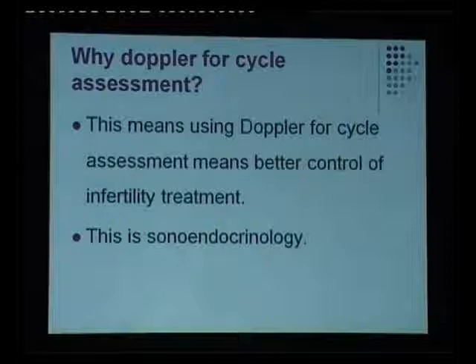This was a study in 1996 when color Dopplers were not so sensitive. In today's date, I would say that if there is no perifollicular flow, it's best to wait till you get a perifollicular flow, because the chances of getting a grade 1 or 2 embryo may be as low as even 10%.